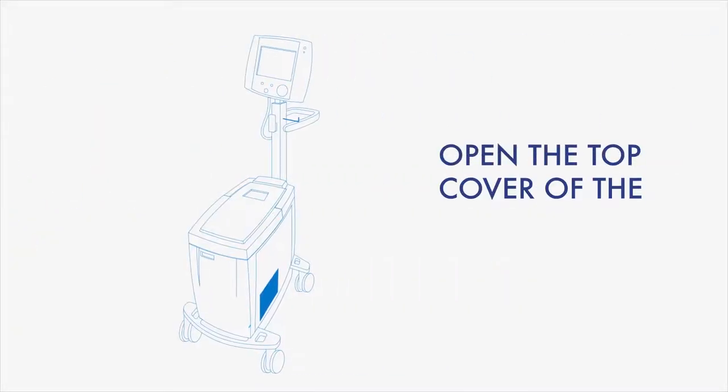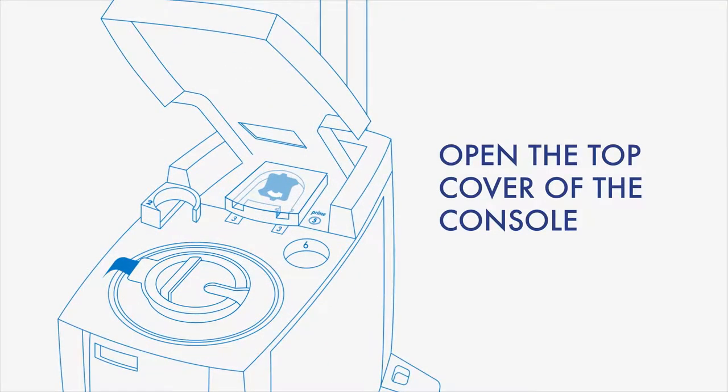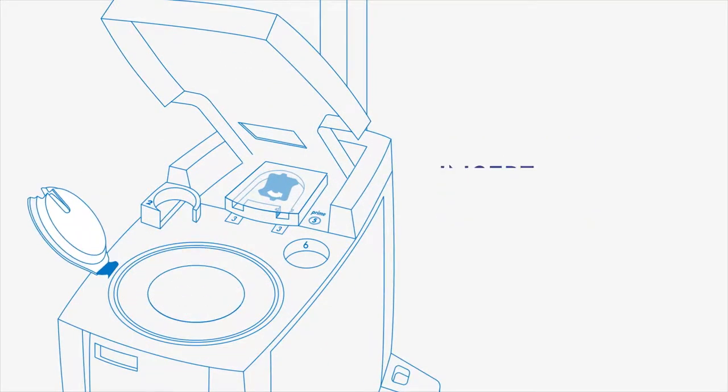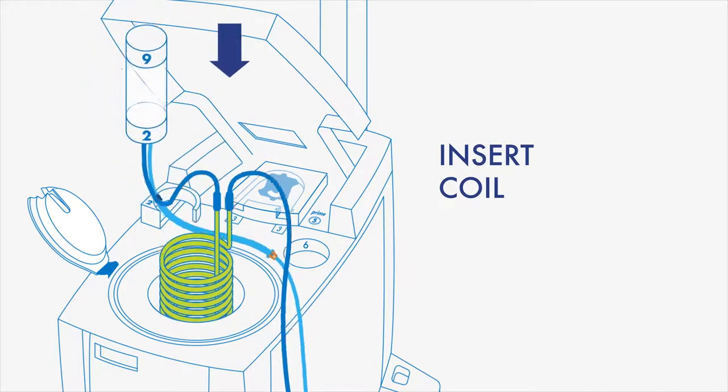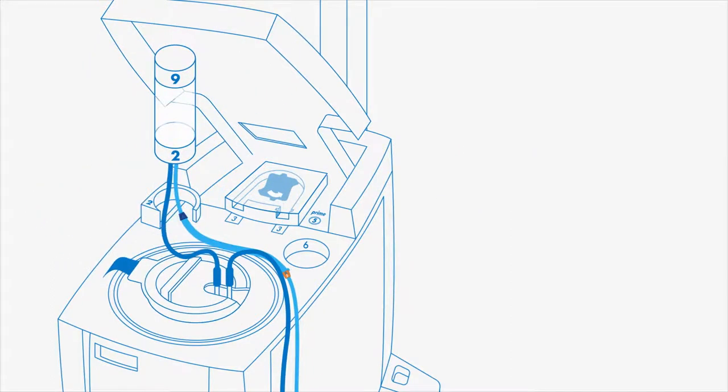Open the top cover of the console. Lift the well cap and place the coil into the coolant well. Close the cap, passing the tubes through the slit.